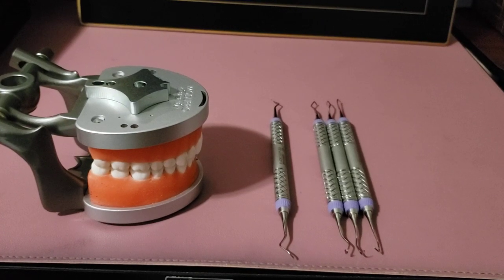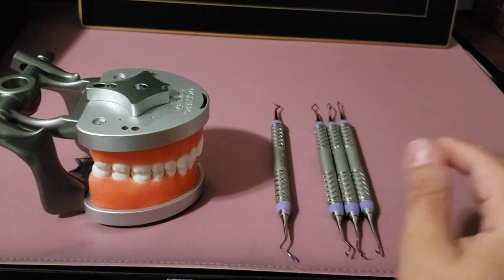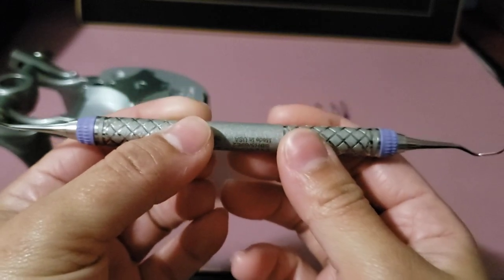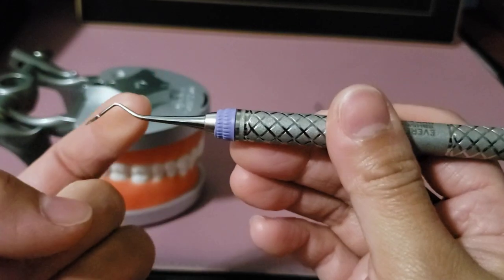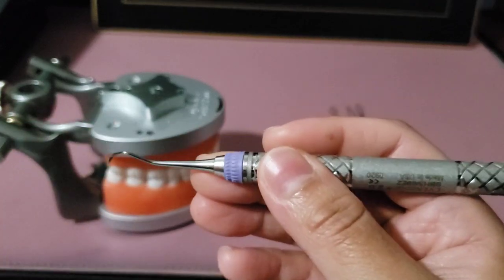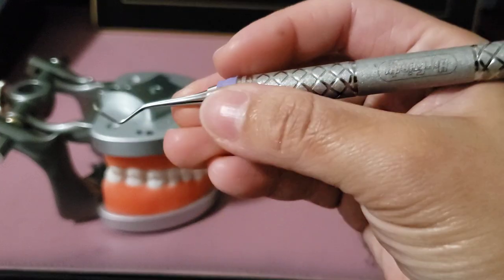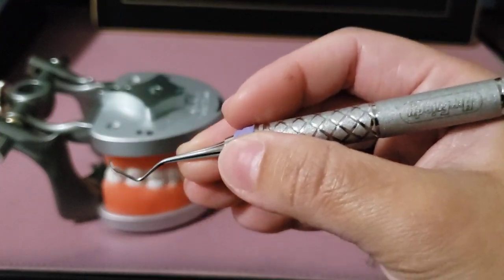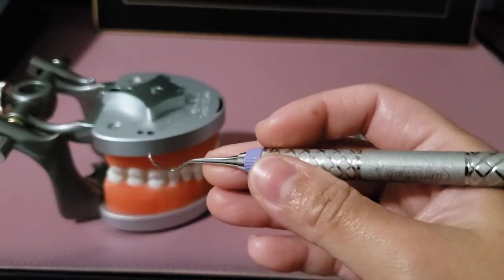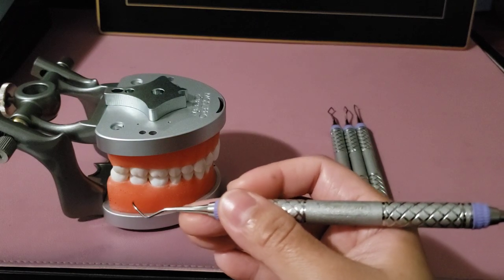In this video, I'm going to show you important concepts and differences between the universal and Gracey curettes. These instruments have a handle, a terminal shank, and a working end with a rounded toe. These are subgingival instruments used with a modified pen grasp using moderate to firm pressure against the tooth. However, they are not used on newly erupted teeth, demineralized areas like decay, or patients with an active infection.